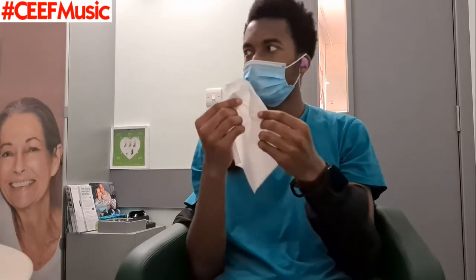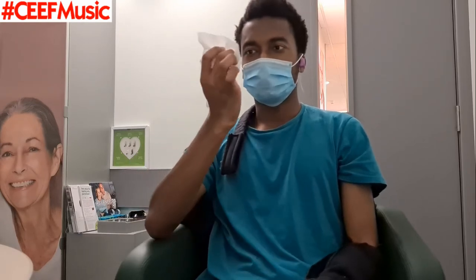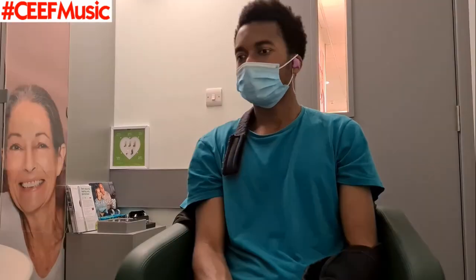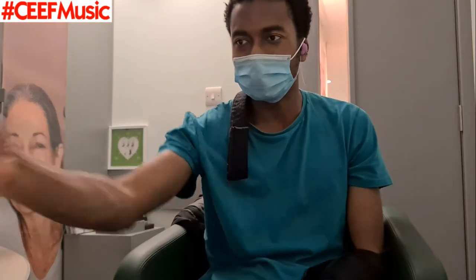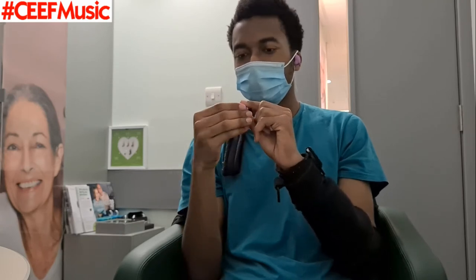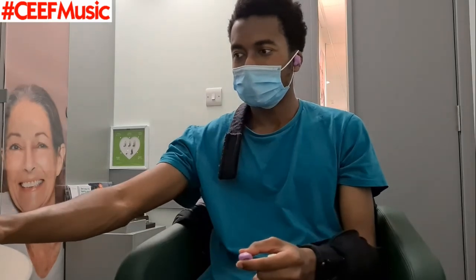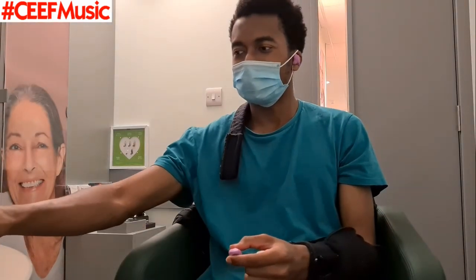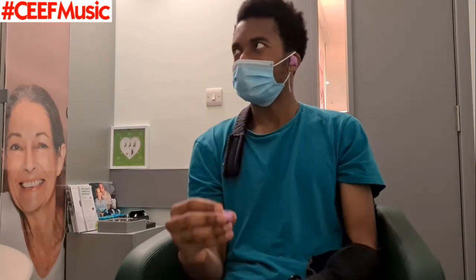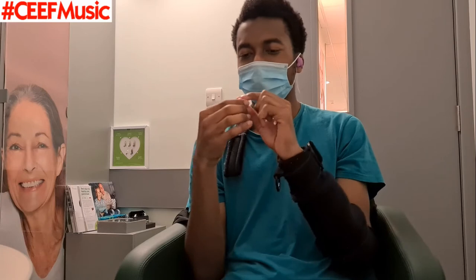The tissue was offered to help me wipe my ears, but I said to her it's hard to know if my ears are clean or wipe them out if I can't see my ears after this process — but it's all good. Now here's the thing: what she did was when she did the last impression, she gave me the leftover — I guess you could call it filling. Basically these two substances by themselves are perfectly fine, but once you mix them together, you've got about five, maybe six minutes max to get that material down the patient's ears, because it then just hardens.